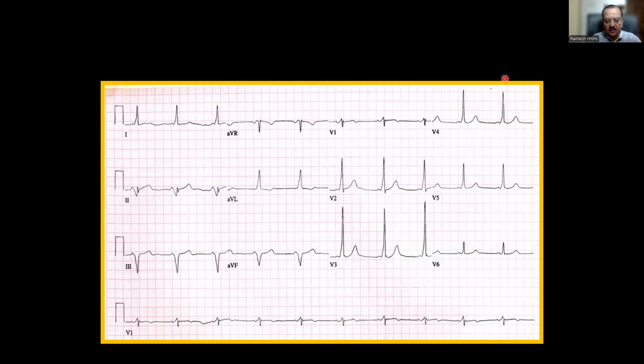P wave immediately followed by QRS. Yes, that's the short PR interval. The diagnosis here is straight away WPW syndrome. Very workable, nothing needs to be done. Just in a fraction of a second, you will be in a position to diagnose WPW syndrome.